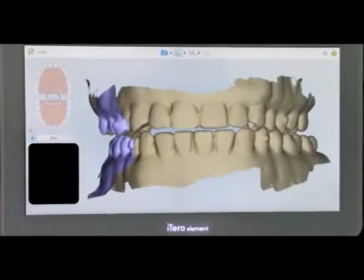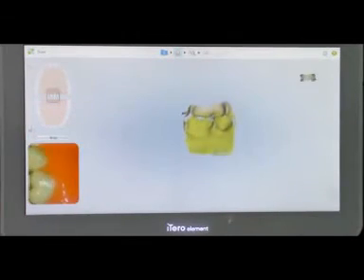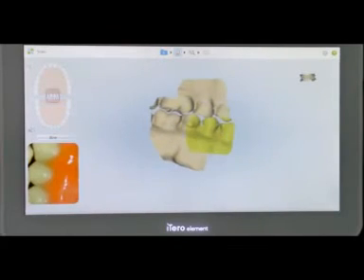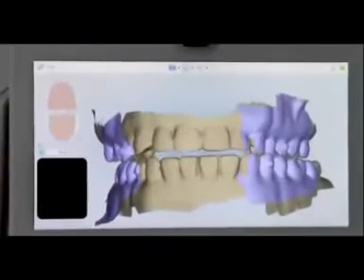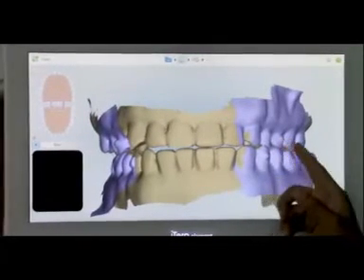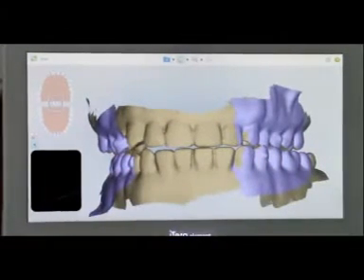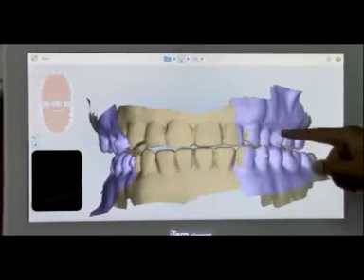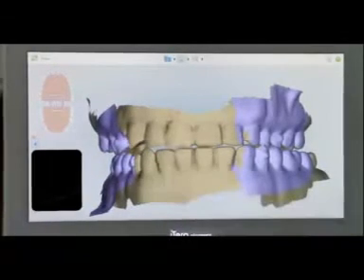This bite is going to be messed up. Again, premolar, nice big wave. Catch some of the gingival margin, and it's going to register like that. Okay? No need for in front? Just that? No, just the sides is fine. The two sides. And don't scan from the premolar all the way to the other side, because then it's going to confuse the scanner. Just up and down, up to the canine. It should jump in, and then stop, and then start on the other side.